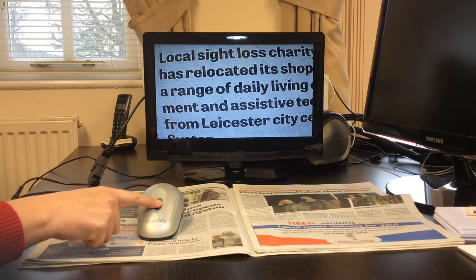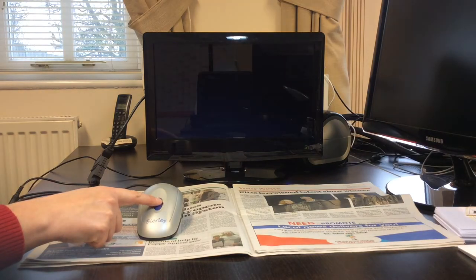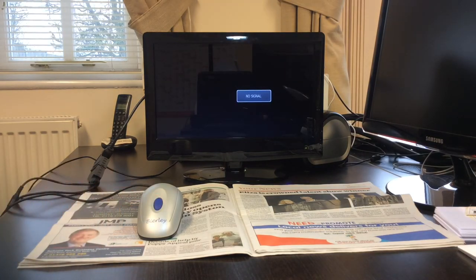To return to watching your television channels, simply press the large button in the middle of the mouse to turn it off.